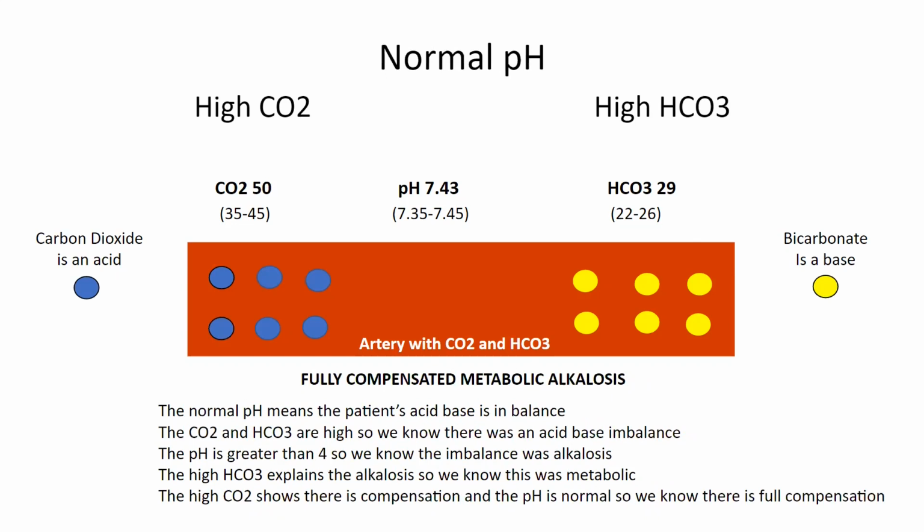And here we have fully compensated metabolic alkalosis. Please pause the video and read the full description before moving on to the next slide.